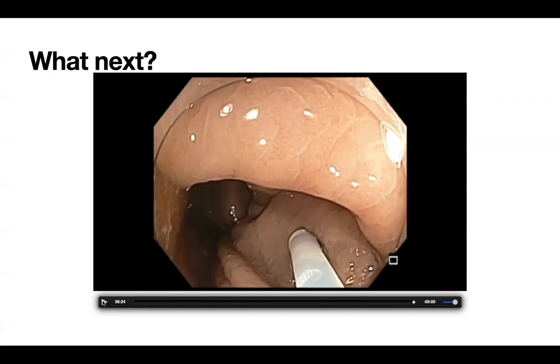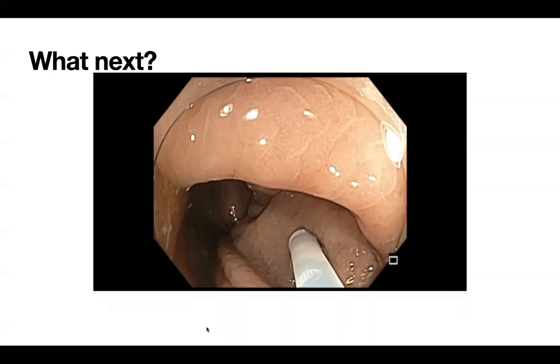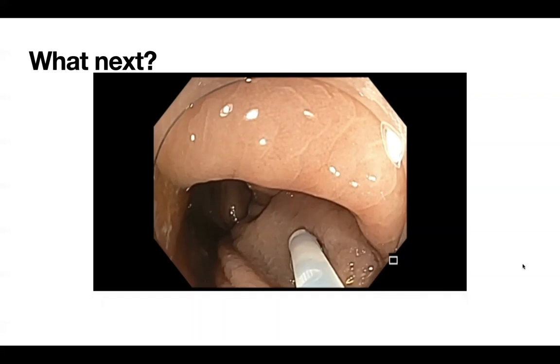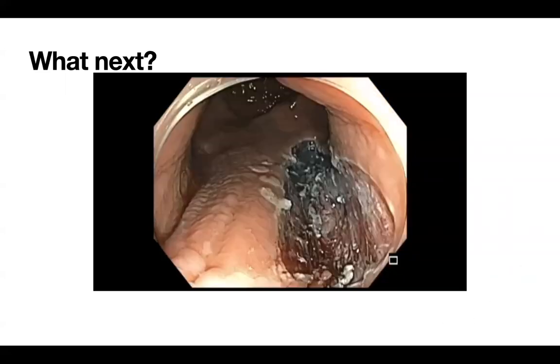I agree. There is no debate about it. Even if it is a prolapsing mucosa causing this, the polypectomy attempts will cause fibrosis, and at least that will be a different way of managing that mucosal prolapse as well. Right. So now you actually see the resection.